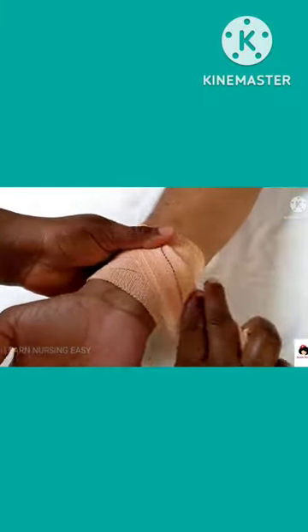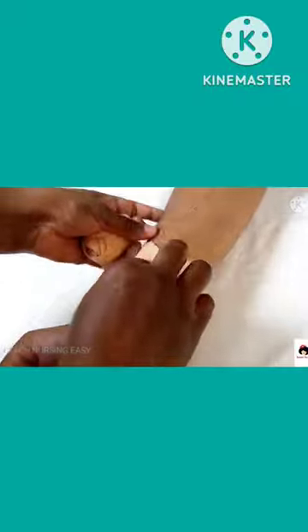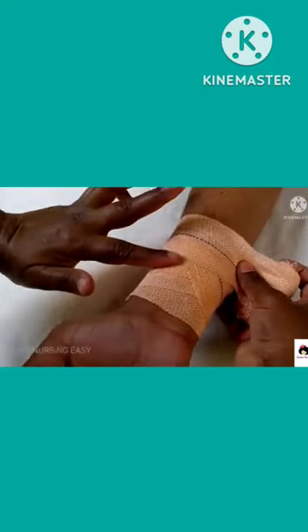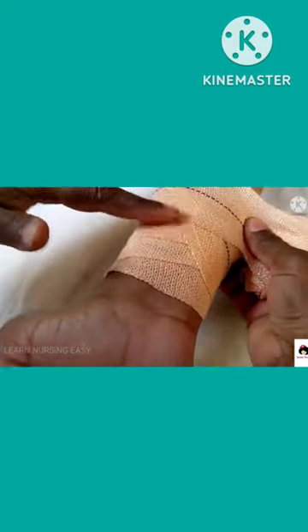Once you reverse it and then go back like this and make a clockwise rotation, this is called reverse spiral. Always see that at least one to two finger gap is there in the overlapping bandages.